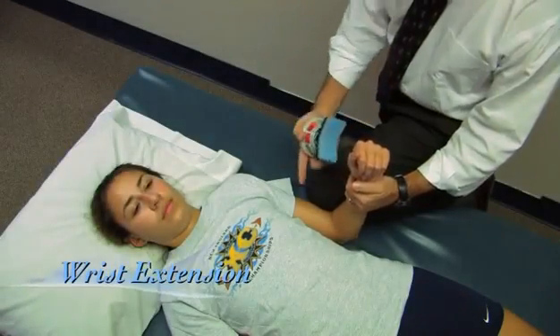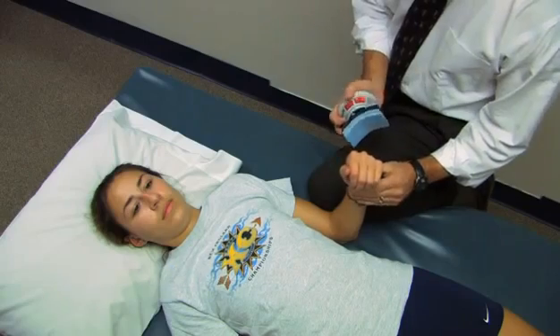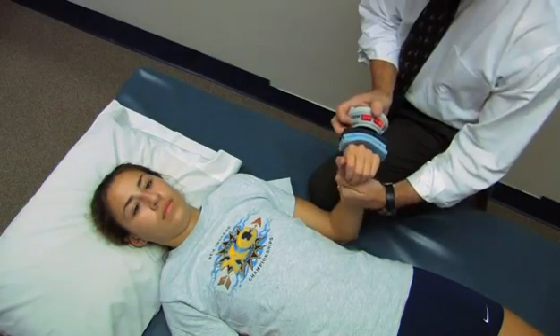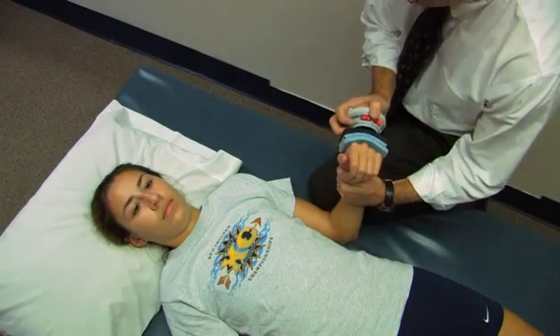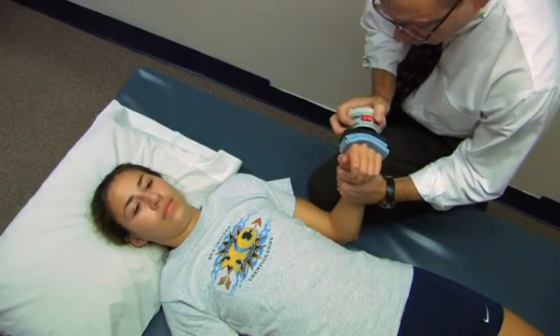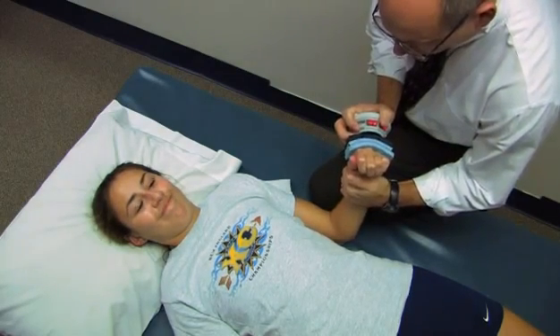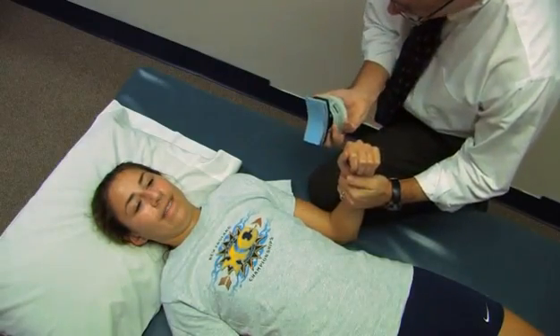Now we're going to measure wrist extension. Elbow generally at 90 degrees, the forearm vertical, the wrist in neutral. I'm going to place the device just here at the distal part of the hand before crossing the MP joints. It's going to be a second or two, then as hard as you can. Go ahead — harder, harder. And relax. 19 pounds.